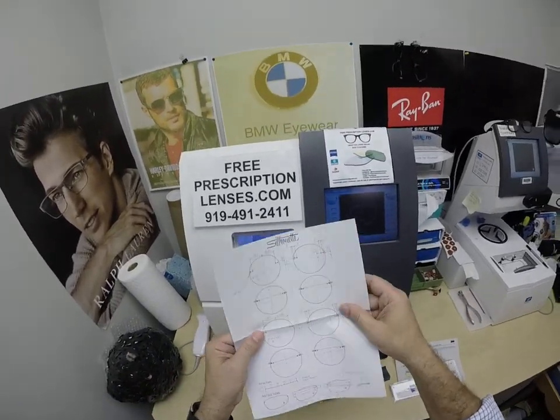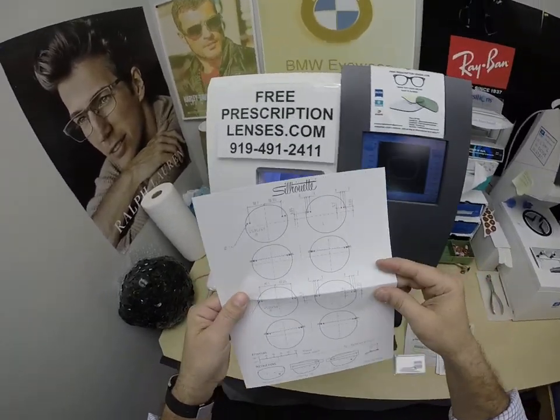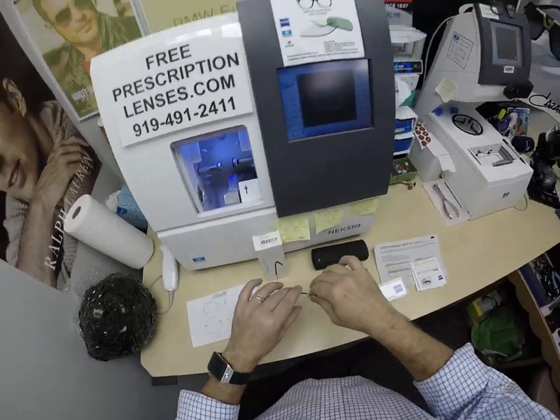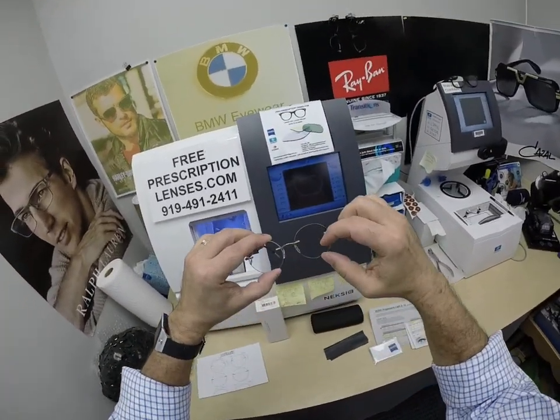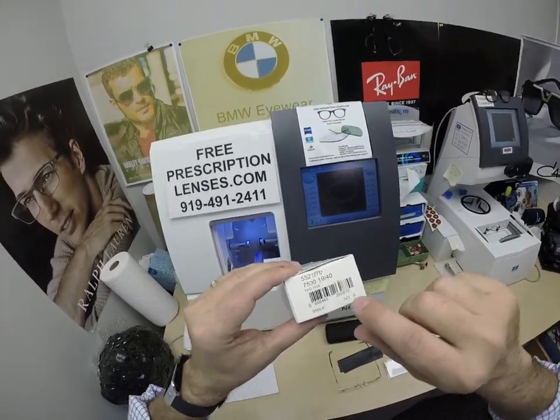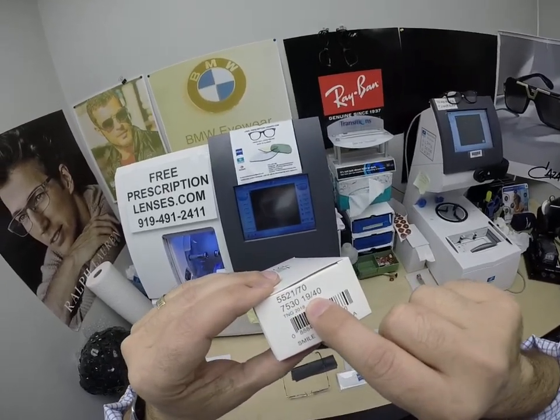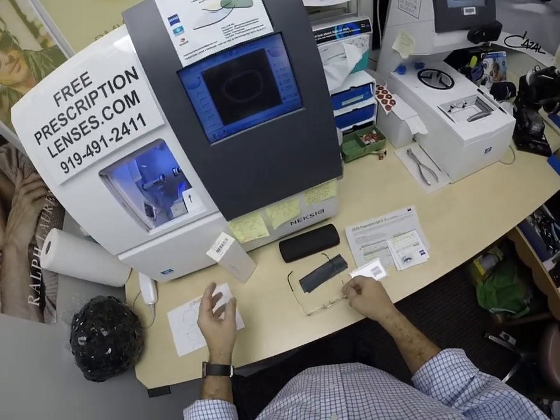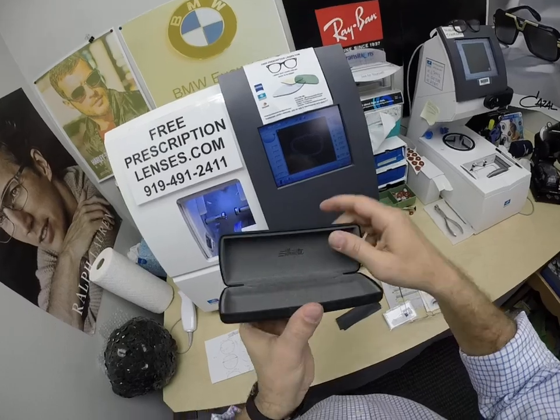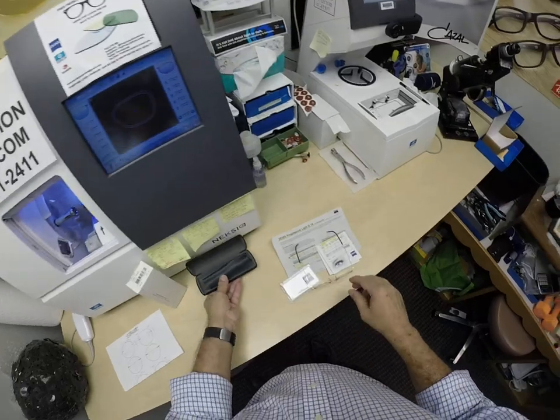This comes in two sizes, 47 and 49 eye size. I can make it a 45 or a 51, or any size you want — I can change the width and depth. The model number is 5521, color 7530, which is the gold. It has a 19 bridge and 140 temple length. Silhouette comes with the hard shell case and a silhouette cleaning cloth inside.